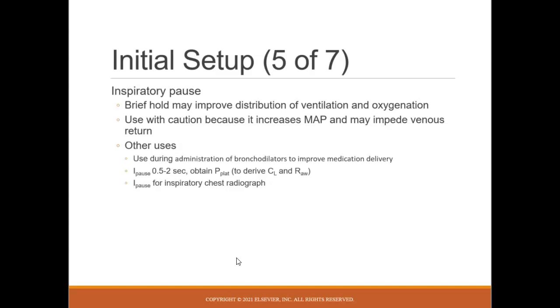It's really not been shown to have enough benefit to warrant the risk of the side effects, which is increasing your mean airway pressures when I'm doing that inspiratory hold. That can have a negative impact on venous return.